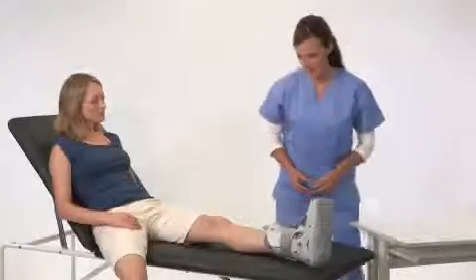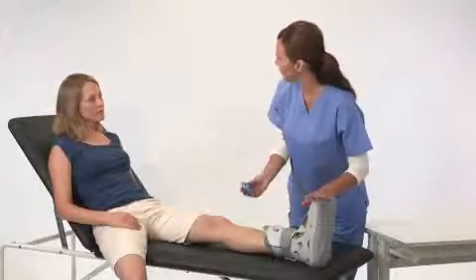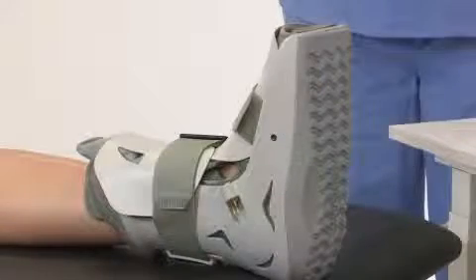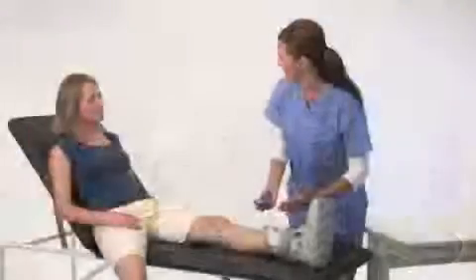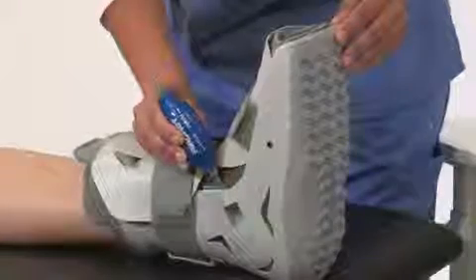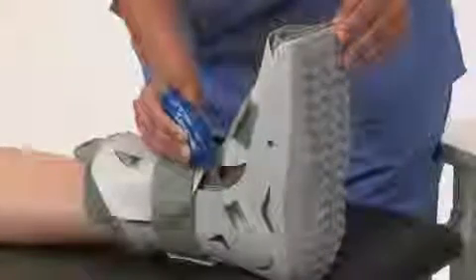Since the SP walking brace air cells are initially deflated, you'll need to inflate them. Start with the valve on the inside of the leg and then follow with the valve on the outside of the leg. To inflate the air cells, simply insert the inflate tip of the hand bulb into the valve and squeeze until the air cell is snug.